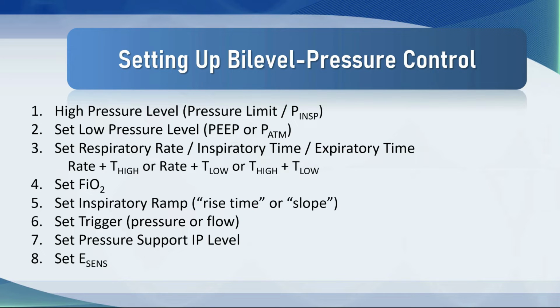Finally, like in all pressure control modes of ventilation, you need to set the P max, and it needs to be at a reasonable level because your patient can actually breathe spontaneously at the high pressure level, and you need to be careful that they don't overpressurize the system.